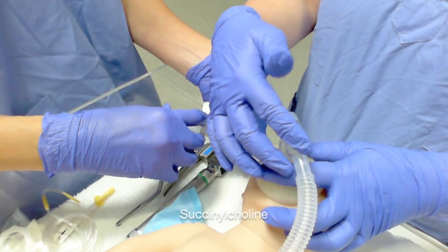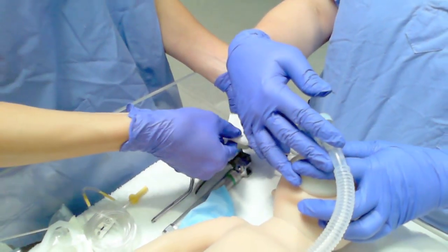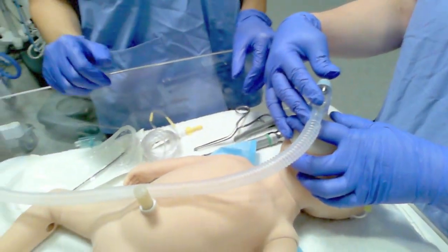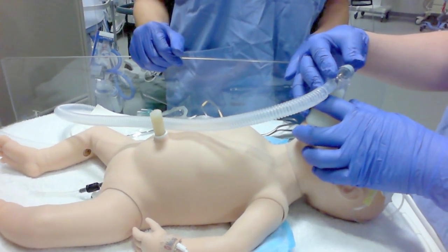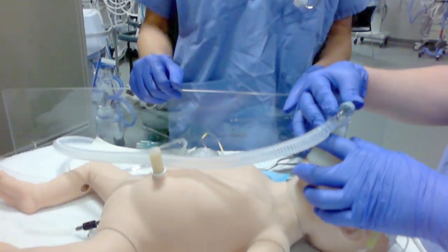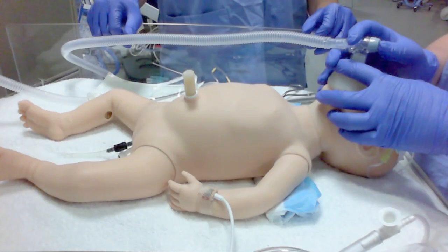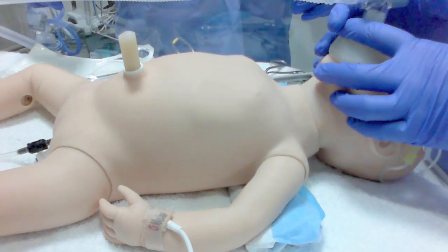Paralytic going in. Ensure adequate chest rise with PPV.